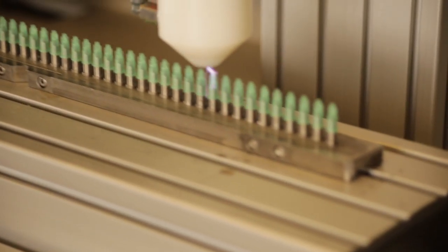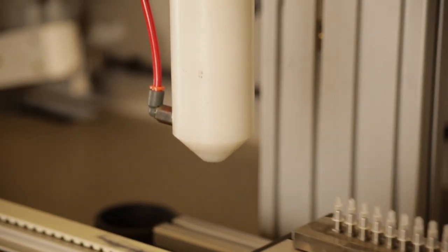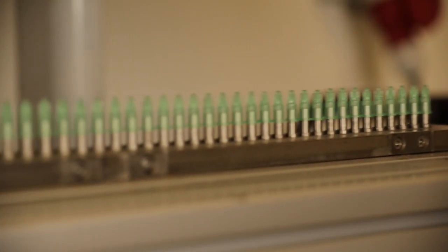The Needle-Tec can be designed for both inline and continuous operation. Having three different technologies to treat needle hubs, this system is extremely customizable to fit your production needs.